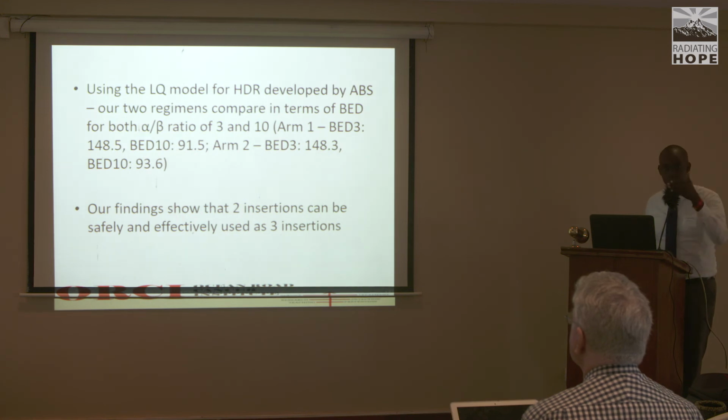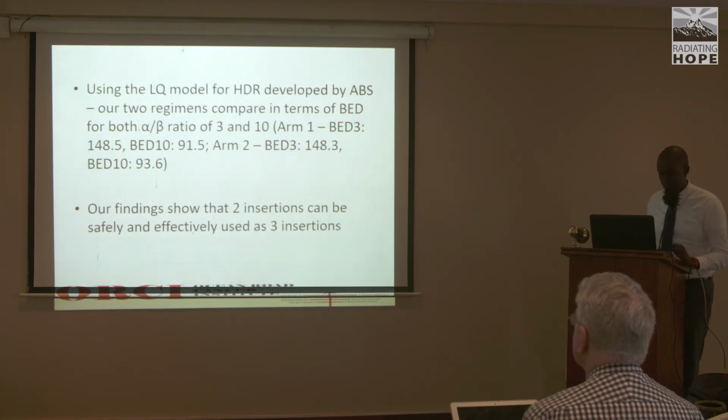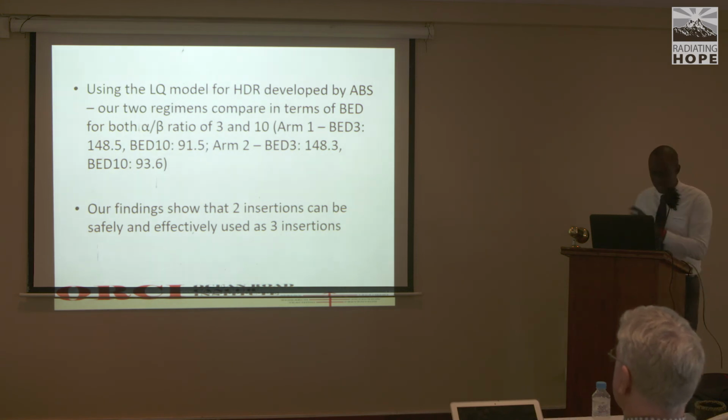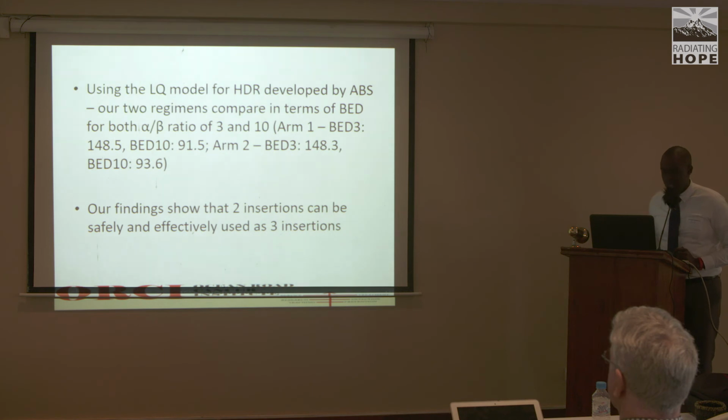It also has an LDR and a PDR slide as well. We can go through it within the break. And our two regimens actually do compare in terms of BED, as shown. And our findings show that 2 insertions are as effective and as safe as 3 insertions.